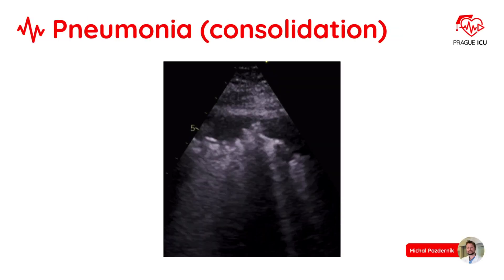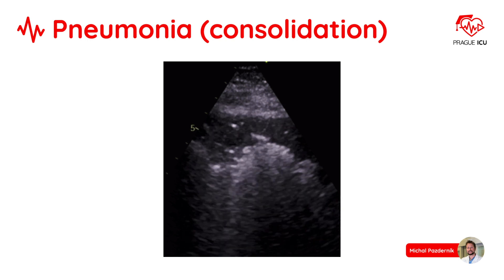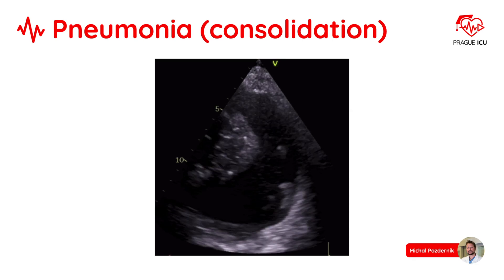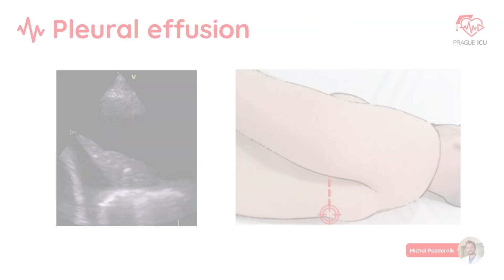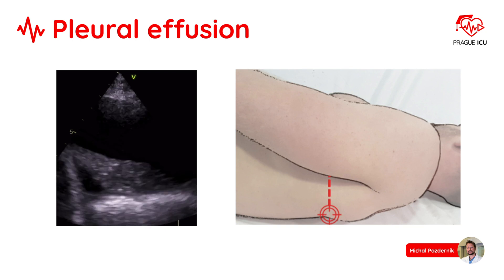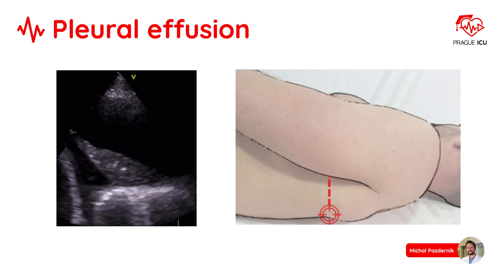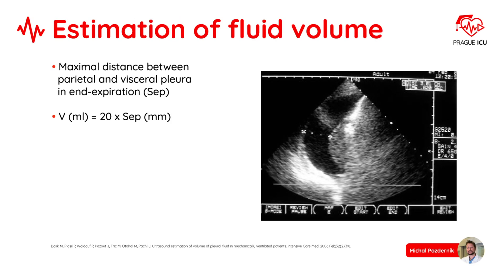On this image we can see an example of consolidation. Compared to normal lung, consolidation on ultrasound has a relatively hypoechoic, heterogeneous echo texture. Another image of lung consolidation here also shows a parapneumonic pleural effusion. For pleural effusion evaluation we always use the echo or abdominal probe. The maximum fluid may be appreciated at the PLAPS point — posterior and lateral alveolar and pleural syndrome point. For estimation of fluid volume we can use the formula: 20 times the maximal distance between parietal and visceral pleura in end expiration.